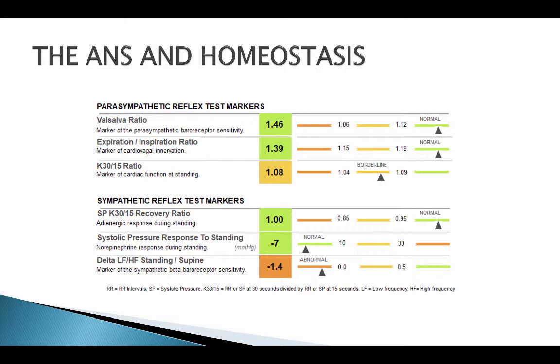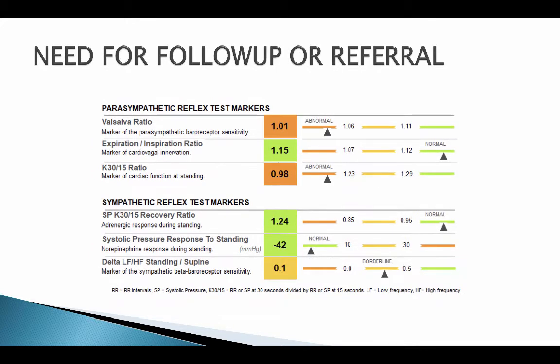And this machine will analyze your heart rate and determine if you have autonomic neuropathy. And as a podiatrist, this is outside our scope of practice, but we would consider the referral to a cardiologist or the primary care physician, and also sending them a copy of the results.